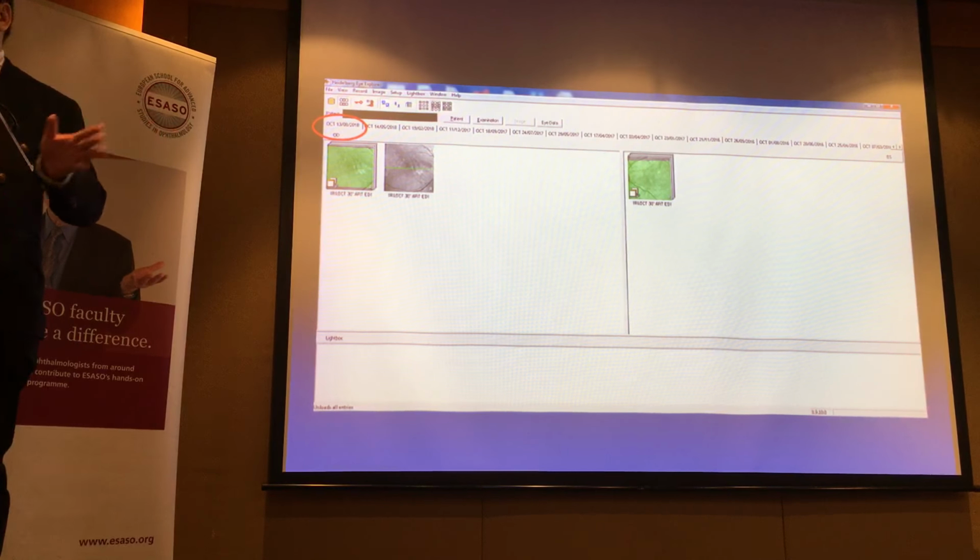But it wasn't done. But if you don't check this, you can make mistakes. Of course, if your clinic is set up such that it's always done when you order it, then that's fine. But at some point, patient will forget, patient will just come straight to your room and so on. But I think that also illustrates the point. I personally feel, and again, I would like to hear your opinions on this if you have a different view, that's why I always tell my juniors, examine the patient first. And of course, hone your examination skills. Because if you can do that, then you realize, no, this doesn't fit.